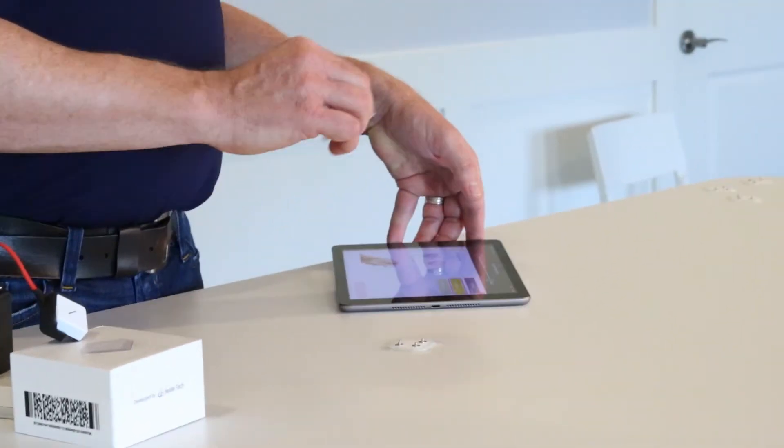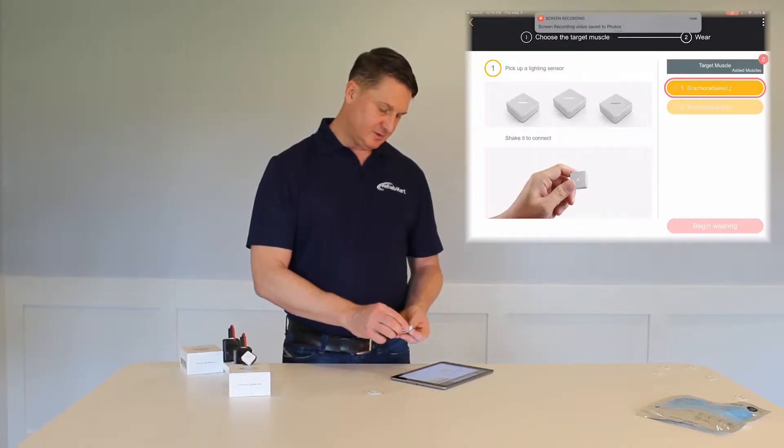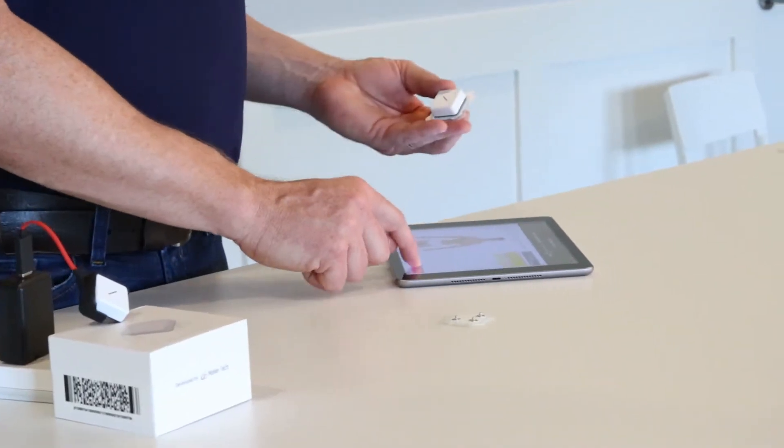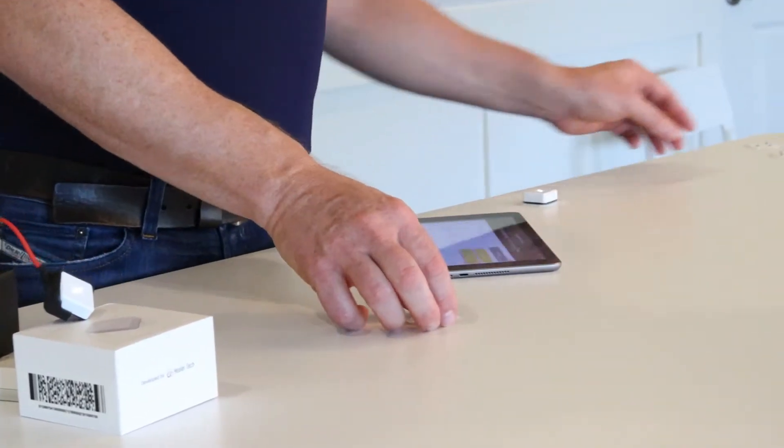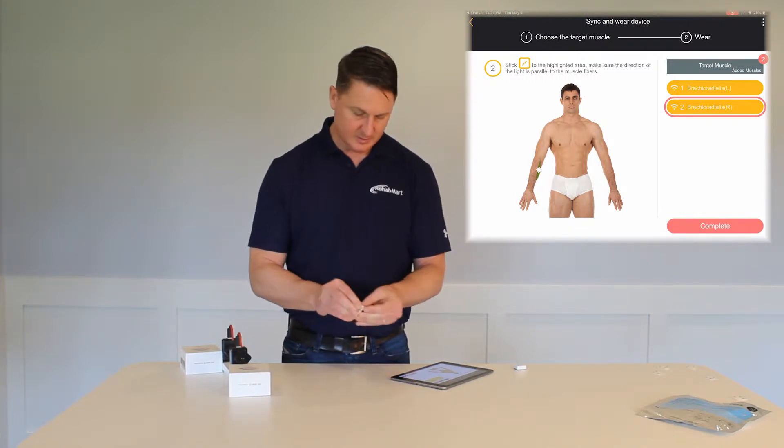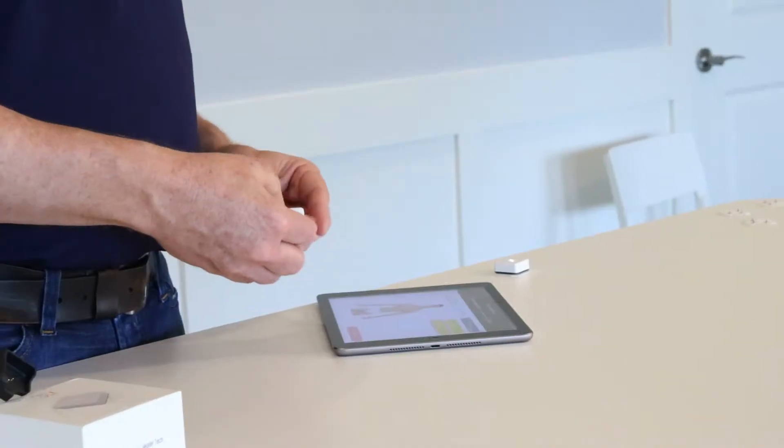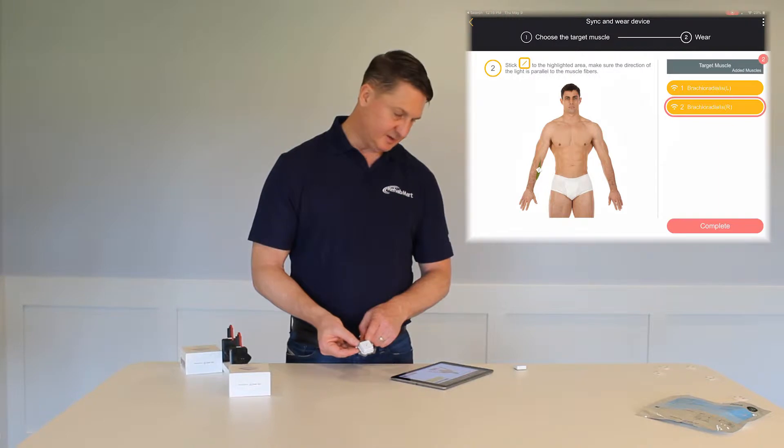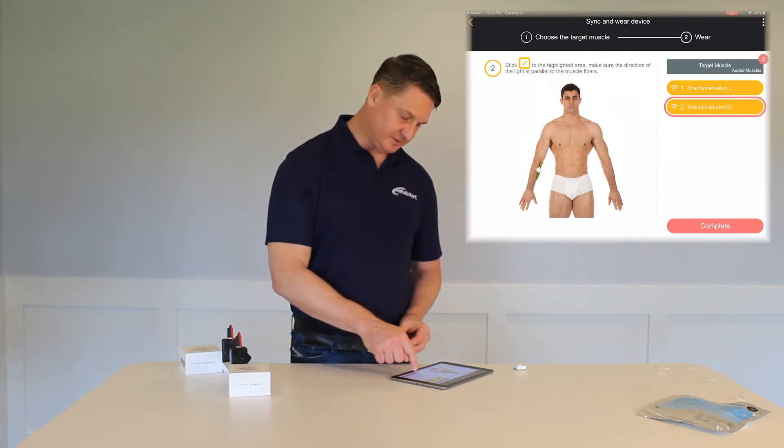I'm going to take the electrode and shake it and it should connect. I click next. Now it lets me connect the right. Shake for the right and the right is connected, indicated by a solid light. It says complete here.